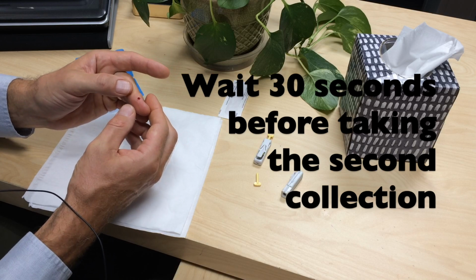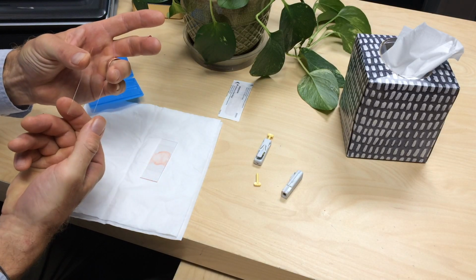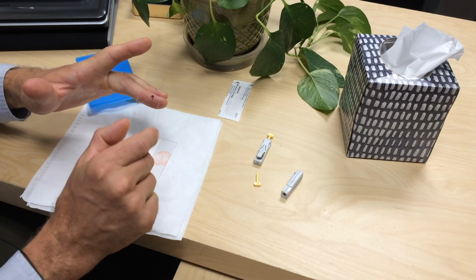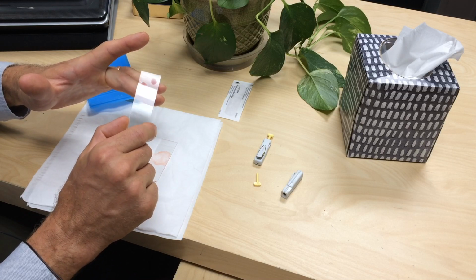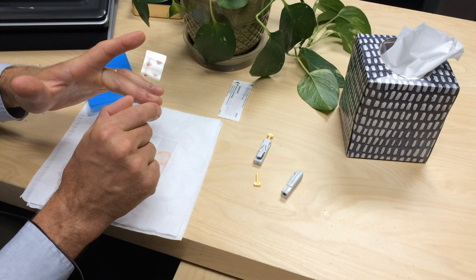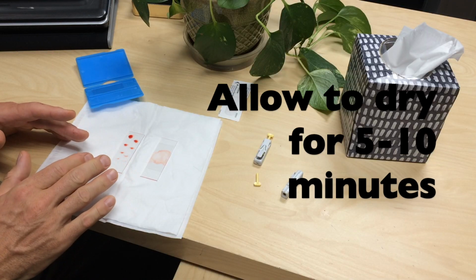And we want to wait about 30 seconds before we take this collection, at which point we take the other slide, flip it over, and we're going to take 8 different samples. This one, the slide can touch the finger. 1, 2, 3, 4, 5, 6, 7, 8. Now don't forget to flip this back over and then allow those to dry.